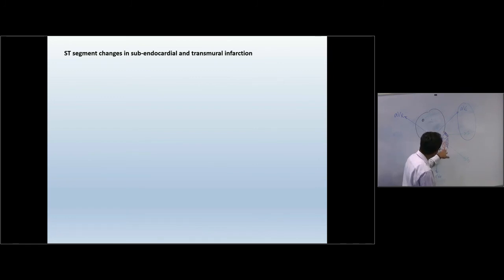Okay. Now, when the patients are experiencing subendocardial ischemia, this area doesn't allow the electricity to travel through the muscle. So the electrodes which are situated next to them will not get electricity, because this surface bounces all the electricity backwards.